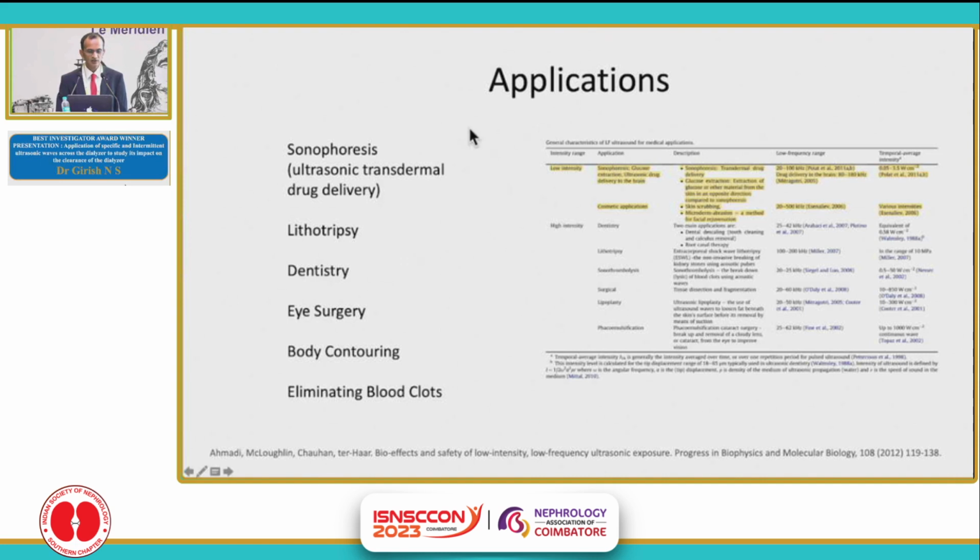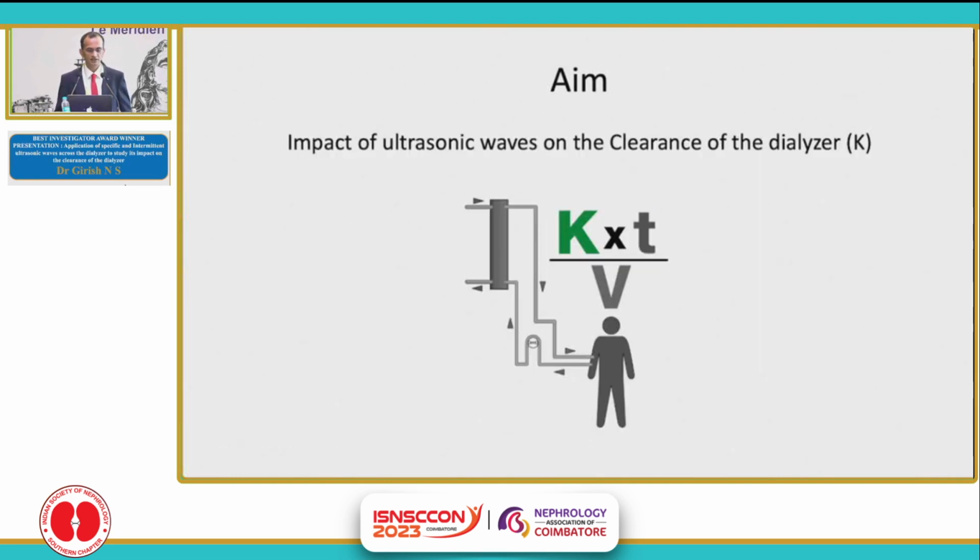Just to highlight a few, it's used in transcutaneous drug delivery, lithotripsy, dentistry, eye surgery, body contouring, and in some aspects to dislodge blood clots. So the aim of our study was to study the impact of ultrasonic waves on clearance of the dialyzer.